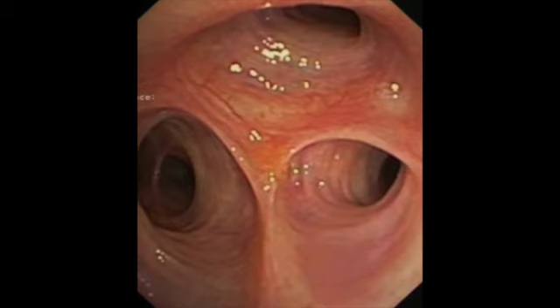Our goal while looking down the bronchial lumen is to ensure that the lumen is unobstructed. We also want to make sure that the bronchial carina is distal to the tip of the endotracheal tube. Now that we have verified placement of our dual lumen endotracheal tube using the fiber optic bronchoscope, it's time to isolate the operative lung and ventilate the non-operative lung.